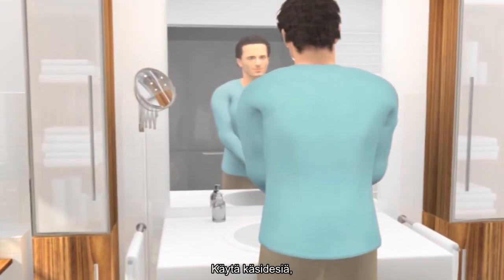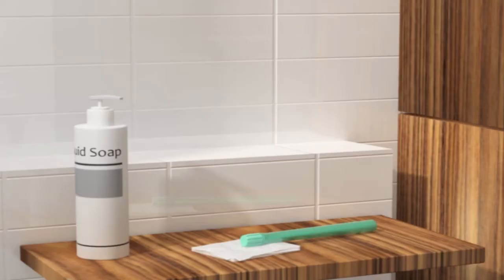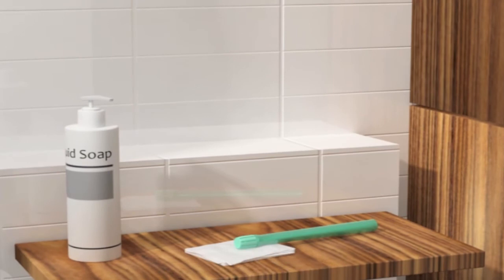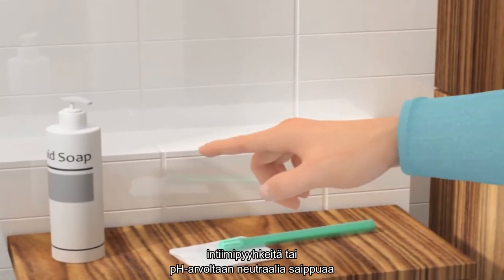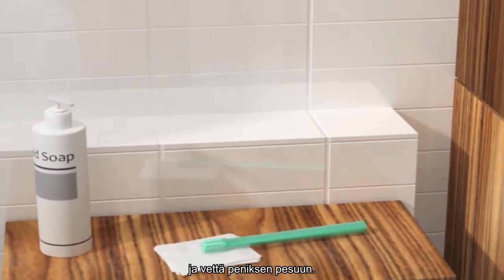Alcohol hand gel can be used if you don't have access to washing facilities. Make sure you have all the equipment you will need before you start. You will need a catheter, intimate wipes or soap with neutral pH value and water to clean your penis.